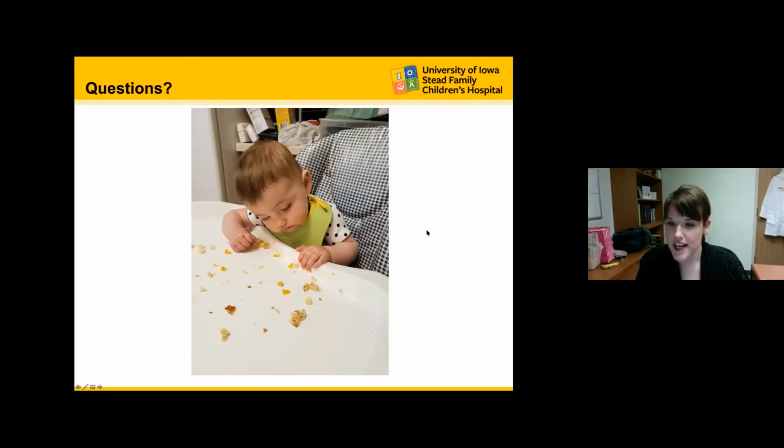Talking about renal ultrasound, do you think it is important to look for ureteral jets intentionally? I am definitely open to hear your guys' comments on this. This was not something that I ever thought it was important to visualize. Sometimes in the setting of obstructive stone disease, but it's not something that I pay a whole heck of a lot of attention to when I look at renal and bladder ultrasounds.